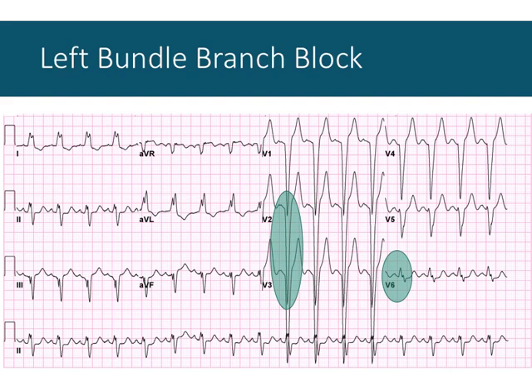I should also mention that's happening this week in lab for Group A, right? And we want to try the 12-lead ECG while exercising. If that doesn't work, I'm going to default to just everyone can do a resting 12-lead ECG if you want. It's nice to have your own trace and then go through the process of looking for rate, rhythm, axis, hypertrophy, etc. as we get through it.